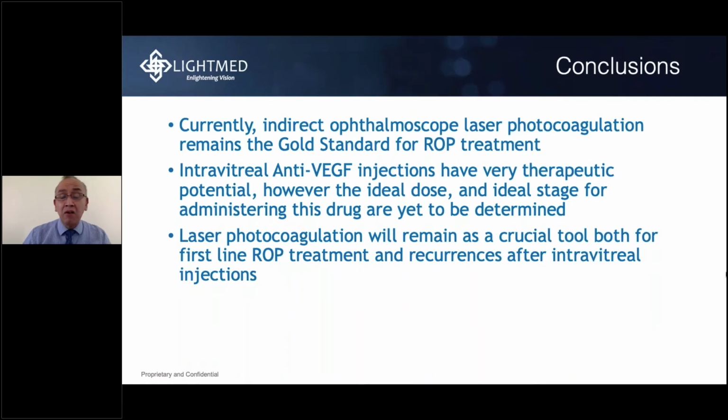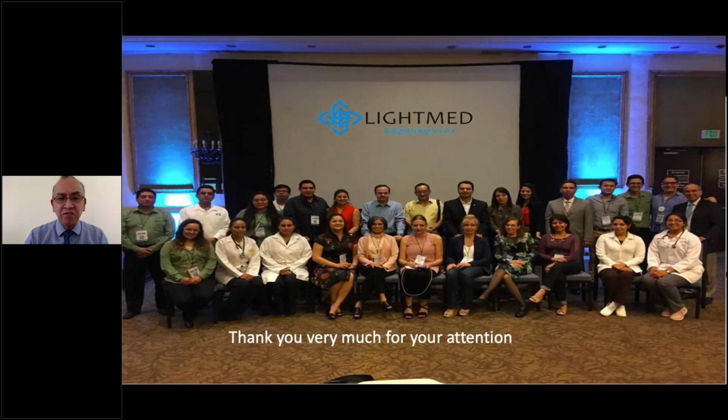And my final conclusions are: currently, indirect ophthalmoscope laser photocoagulation remains the gold standard for ROP treatment. Intravitreal anti-VEGF injections have very promising therapeutic potential. However, we don't know the ideal dose or the ideal stage for administering this drug, and it's going to be determined in the near future. Laser photocoagulation will remain a crucial tool both for first-line ROP treatment and for recurrences after intravitreal injections. Thank you very much for your attention.